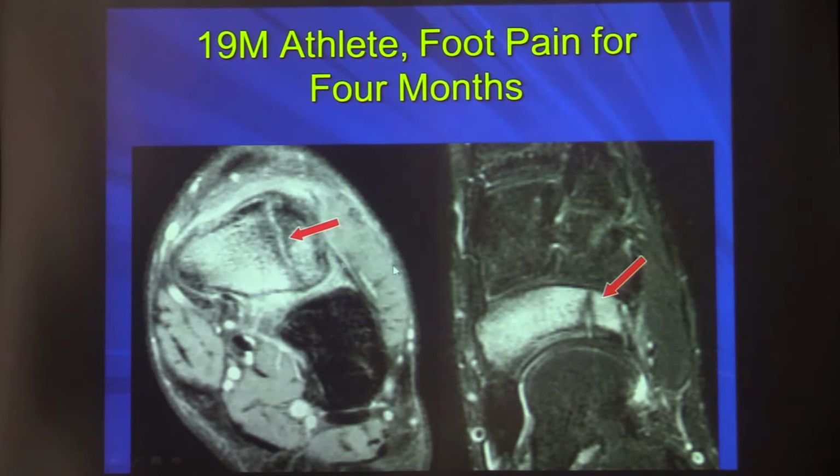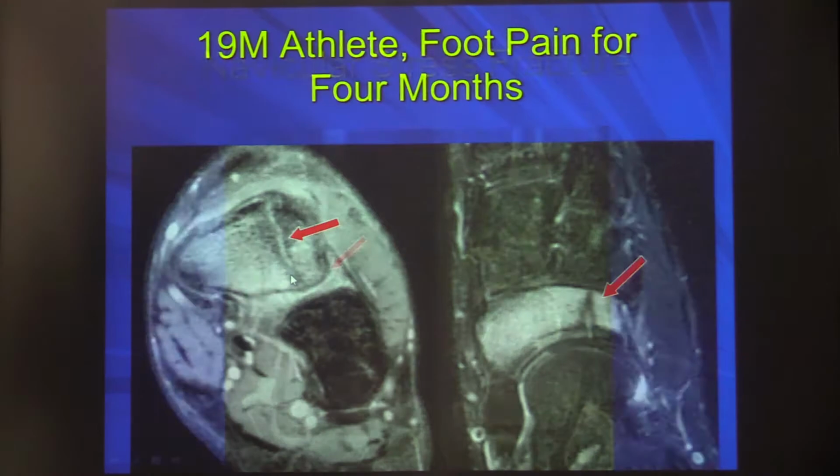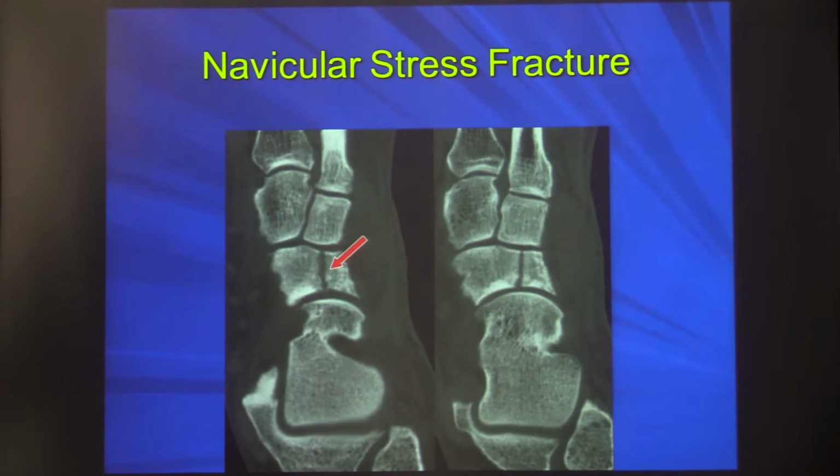Here's another example on CT of a navicular stress fracture. Here's a complete fracture, which traverses proximal to distal. Again, CT will be excellent here to look for healing, especially after surgery.